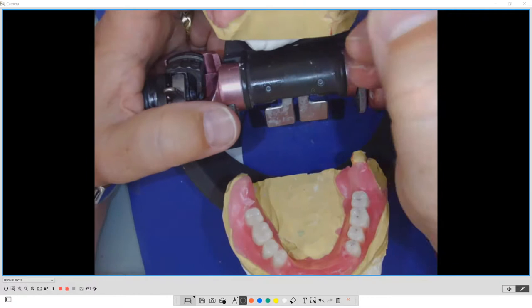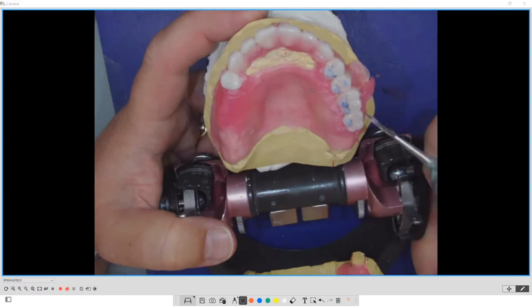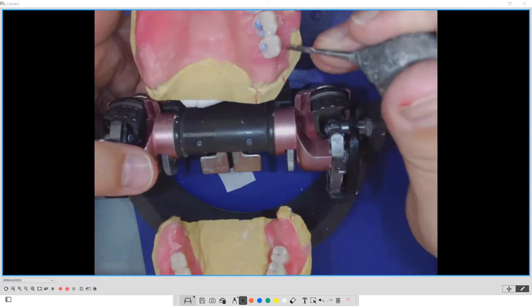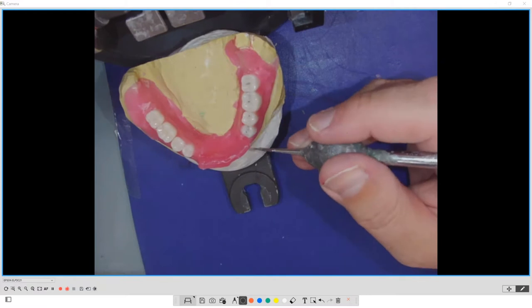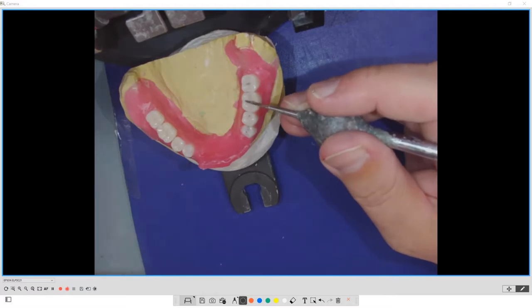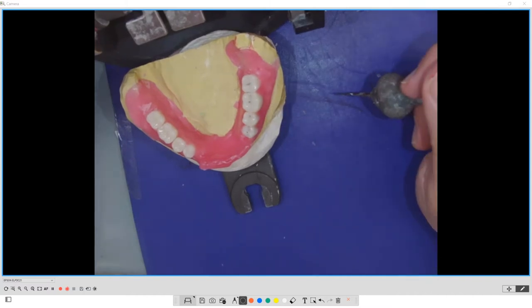So the model analysis allows me reference points to know that I'm setting the teeth within the proper skeletal system and anatomical landmarks of that person. I've identified a triangle zone limit, upper and lower, that I function in according to Gerber, that allows me not to sit over the crest of the ridge, but allows me to move that tooth over a little bit within that triangle, which allows me, again, a little bit more freedom. I'm using a denture tooth that has freedom in it.